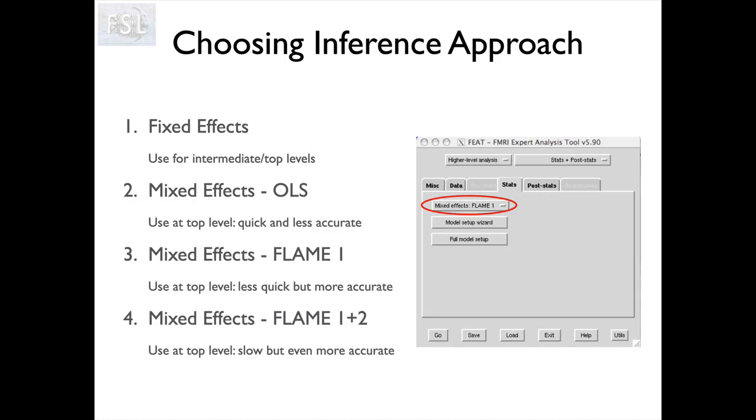There are different options that you can do when you're looking at the feat GUI within FSL in terms of how to do the higher level analysis.